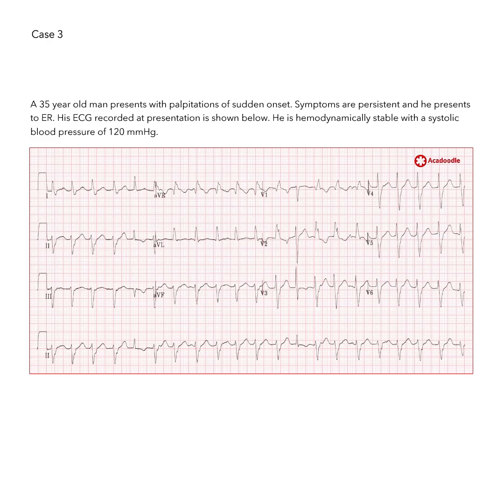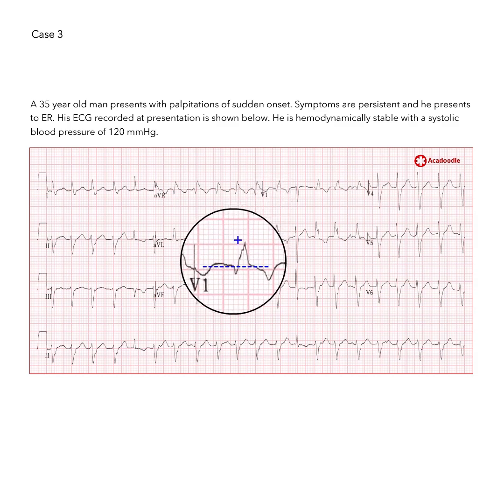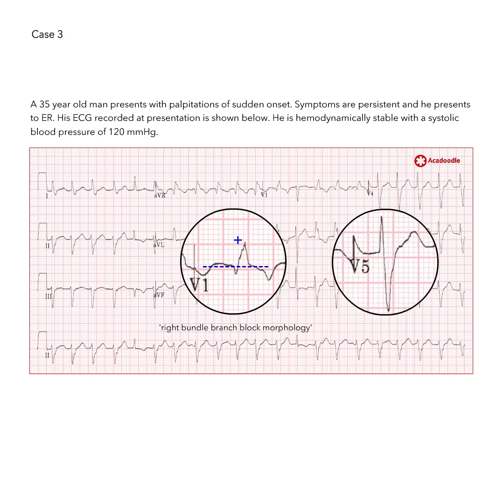On this ECG, the abnormal morphology of the QRS complexes is striking, with a right bundle branch block morphology in lead V1. On close examination, the QRS duration is above the normal range. This is a broad complex tachycardia with a right bundle branch block morphology.